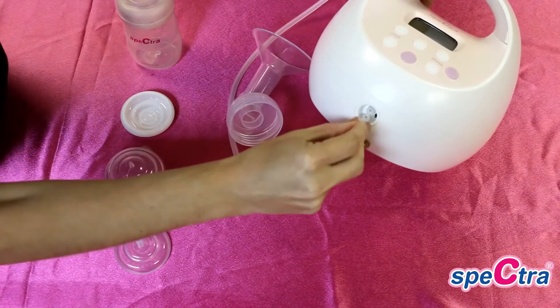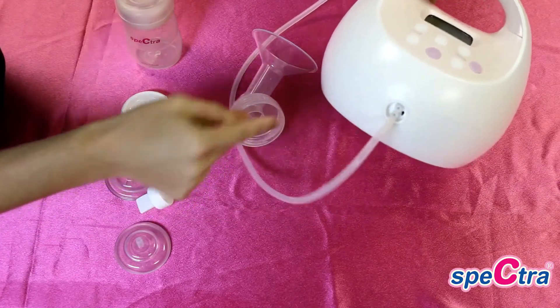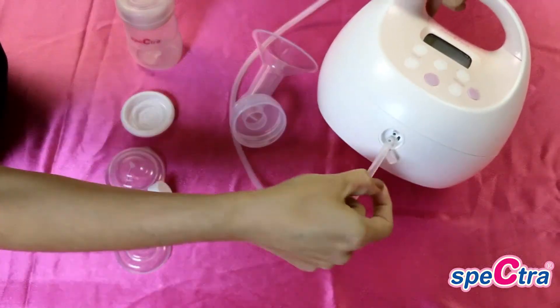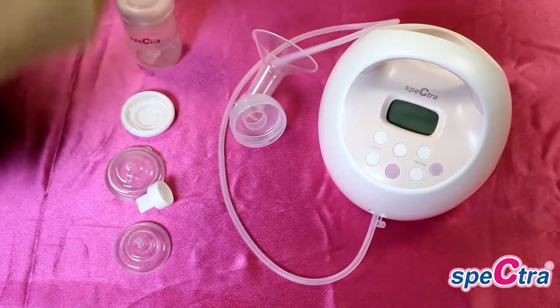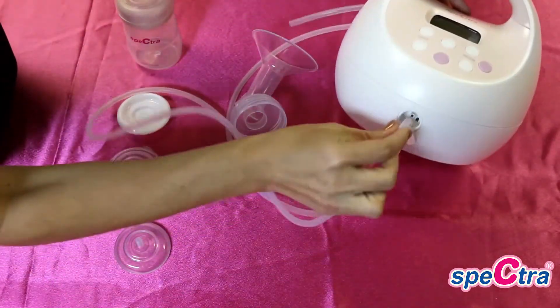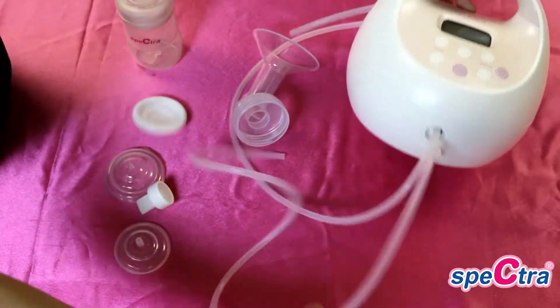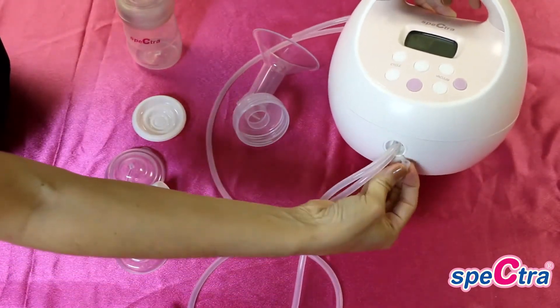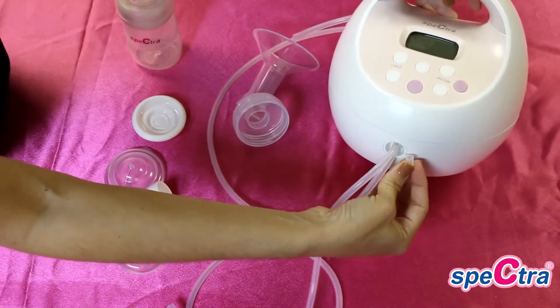You will attach the tubes onto the ports of your pump. For double pumping, remove the air cap plug from the port and attach both tubes. For single pumping, you can plug one side with the cap and attach a tube to the other side.